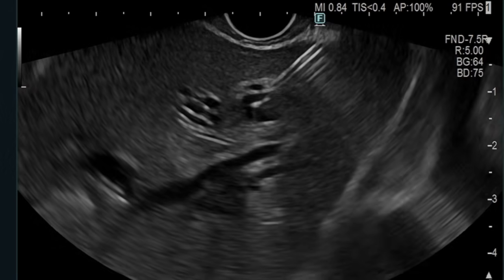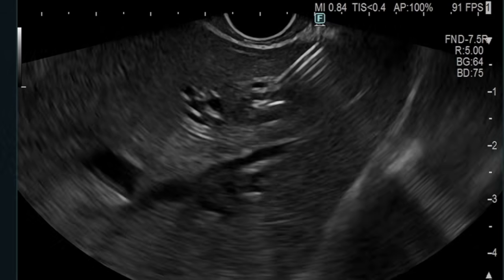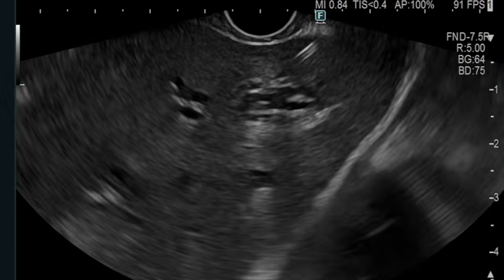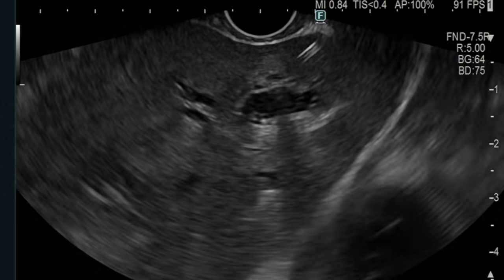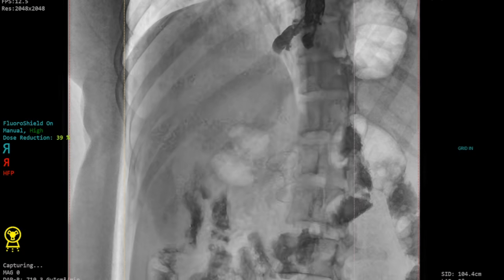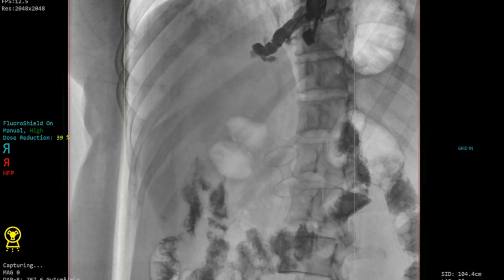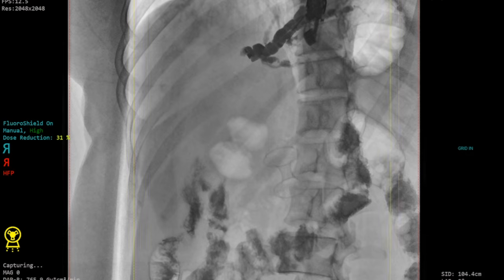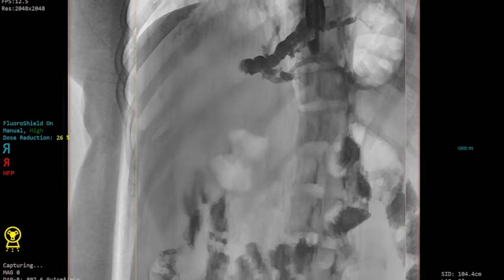The bile duct is accessed with a 19-gauge FNA needle that is primed already with diluted contrast. It is important not to obtain an air cholangiogram as it obscures the view of the ducts, and accidental air insufflation of the hepatic vein has resulted in fatal cardiovascular compromise. Once the bile duct is punctured, it is important to obtain a fluoroscopy image as a reference image. This is critical because if the plane of the transgastric access angle is displaced, a reference image will help the endoscopist to adjust the shaft of the echoendoscope into the correct plane to pursue further treatment.